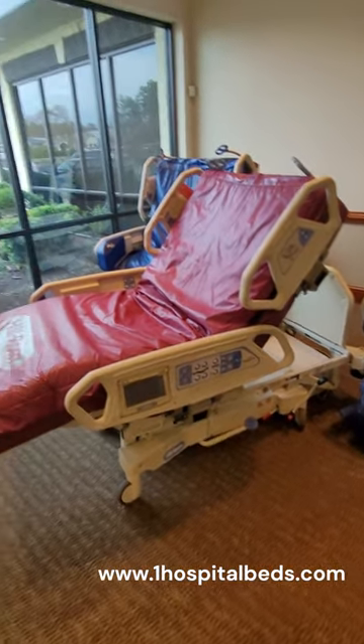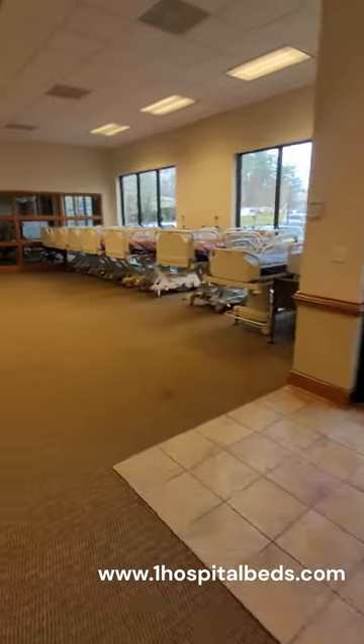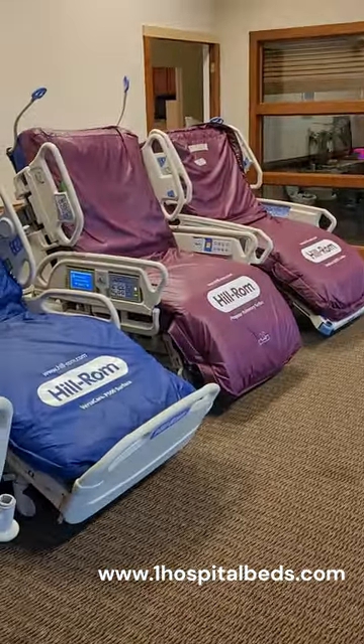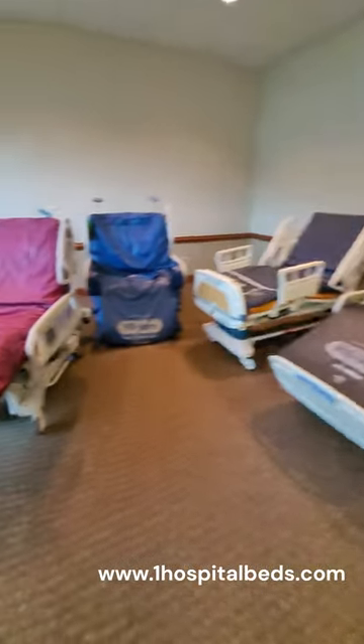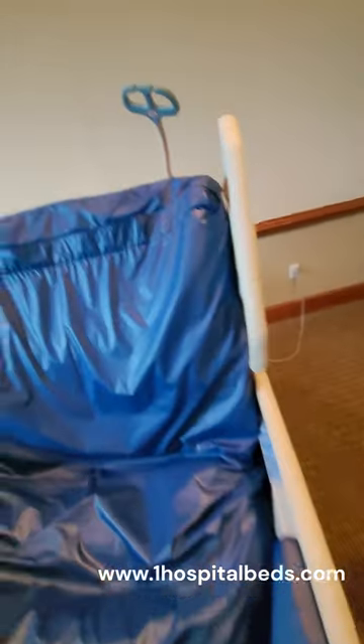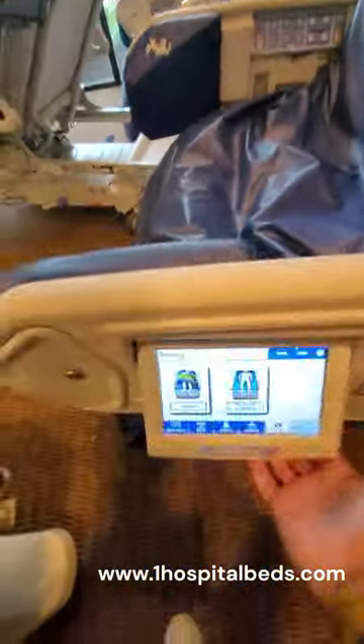These beds are the older version of the Progressa. We have the Progressa beds here in our showroom as well, and you can see the Progressa right there next to a sport bed. It's hard to tell them apart, but they all have the chair position and the percussion vibration. If you want to see how that works real quick here during our short, we'll go to that.